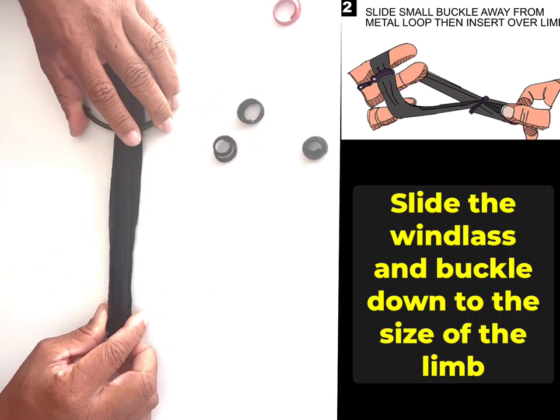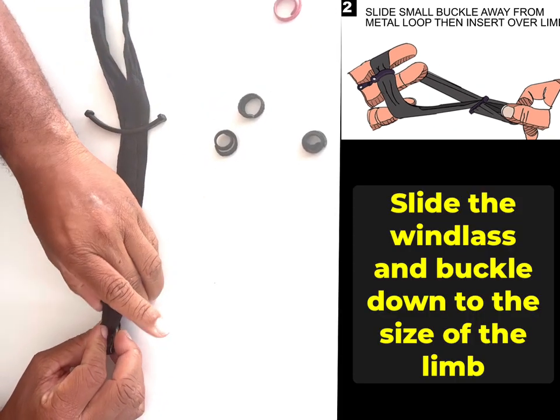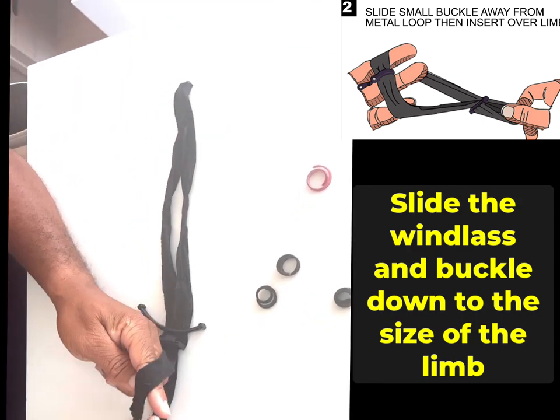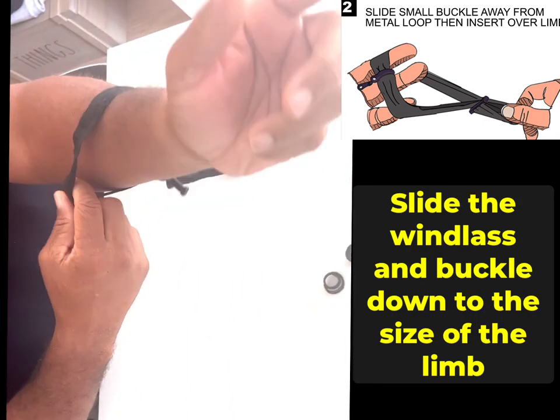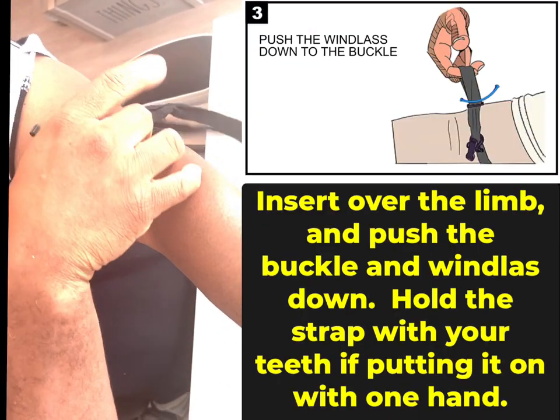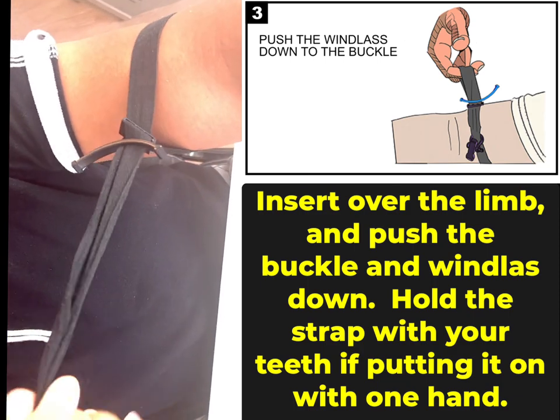You want this space to be about the size of the limb. Now it's ready — this is the ready-to-be-a-tourniquet position. CAT tourniquet — it works pretty much the same.